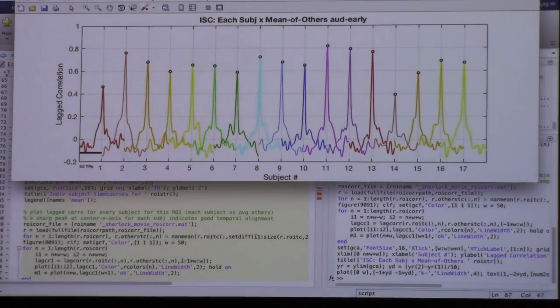The way that we do this is we almost always just use early auditory cortex, partly because we can also match that to the audio envelope of the stimulus, so it's really nice ground truth. And then people who are giving us a correlation of lower than around 0.2 just drop. But that's kind of arbitrary.